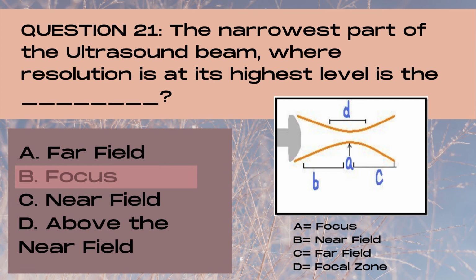The focal zone control on an ultrasound machine narrows the ultrasound beam at the level where it's placed on the image. In breast imaging, you want to use multiple focal zones so that you have narrow regions throughout the ultrasound image, resulting in high image resolution throughout the image. This way, subtle or small breast pathology is not missed.